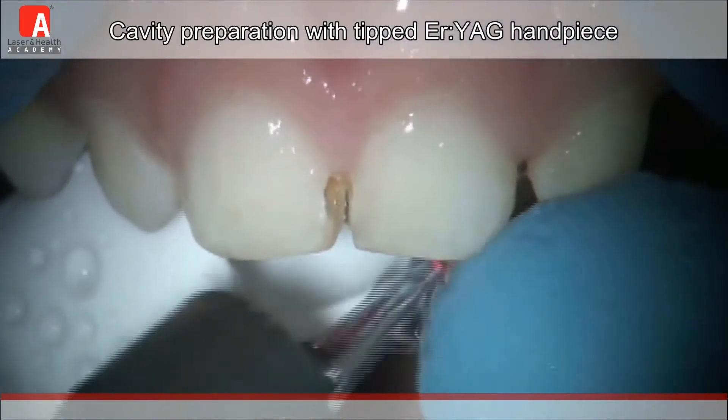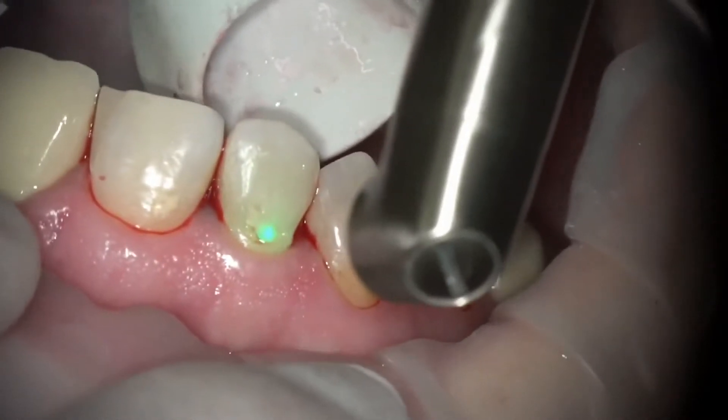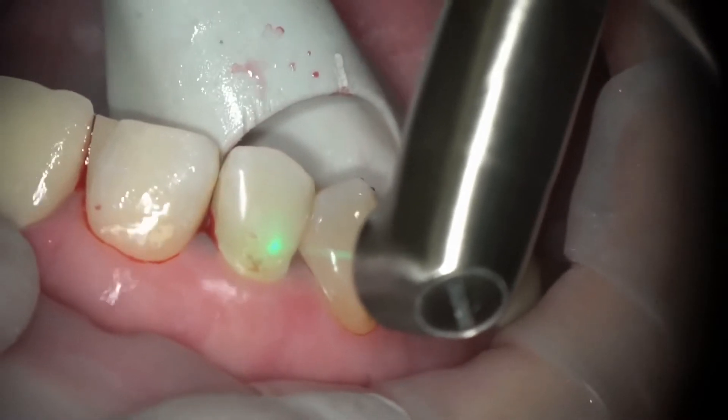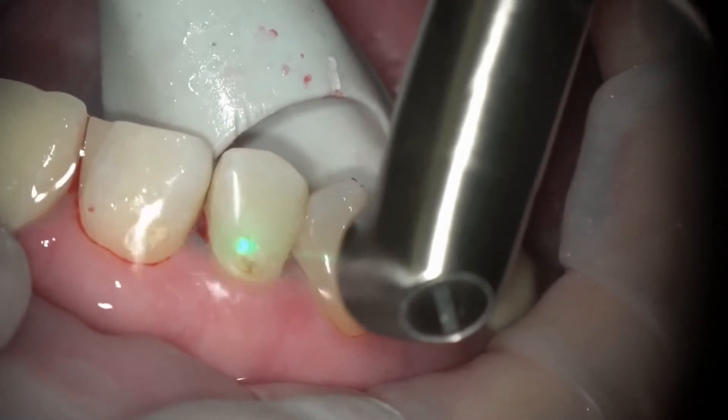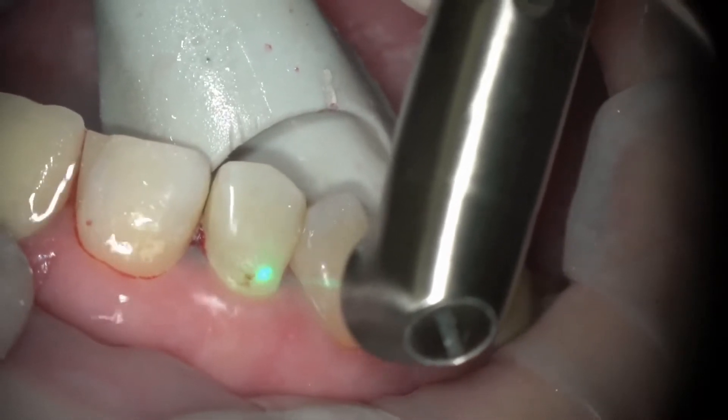Moving on, as you see here, there's a smaller cavity, and when the small cavity is targeted by our laser, we can remove just the decayed tooth structure while preserving the healthy tooth structure once again. In smaller, more superficial cavities like these, you may not even need to get an injection.